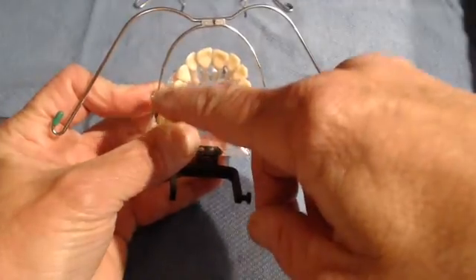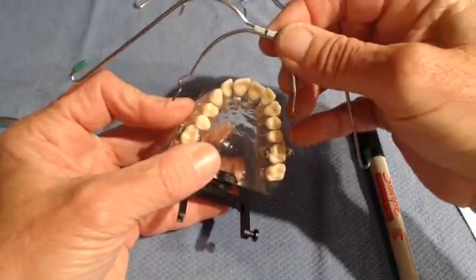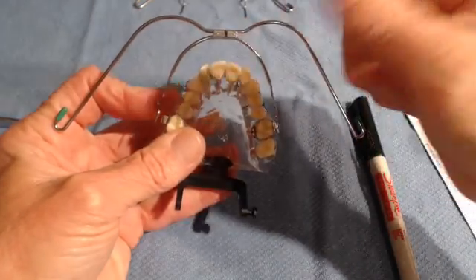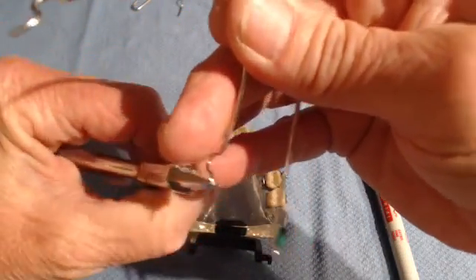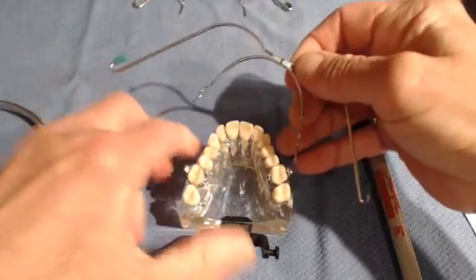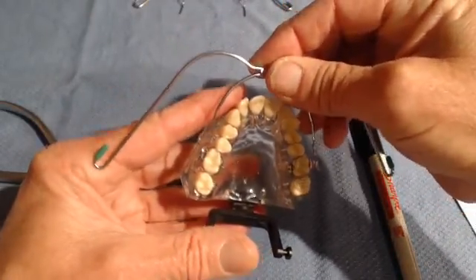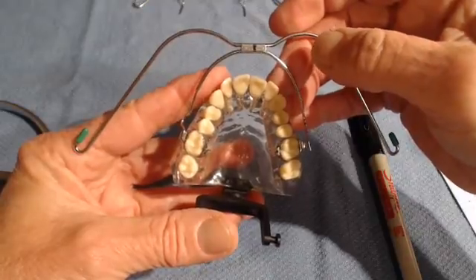Consider the patient's right side molar completed. Now remove the face bow and insert it on the other side to see what toe-in or toe-out adjustment is needed. The midline needs to move to my right — just a little bit, because this side was not off as much as the other side. Now insert only that one side, and you can see that looks pretty good — the middle is in the middle. Check the other side, and the middle is in the middle. It makes sense that if each side fits independently, they should fit together.